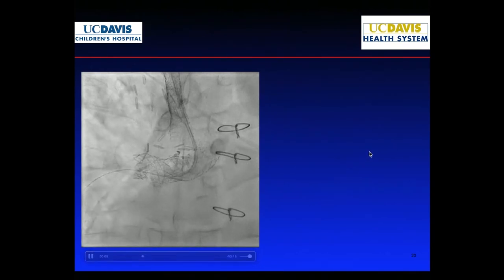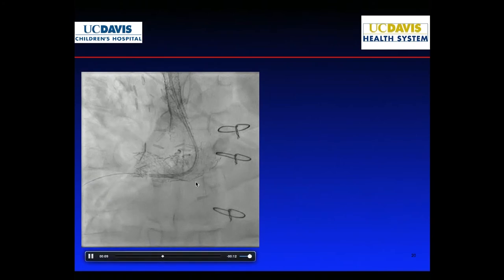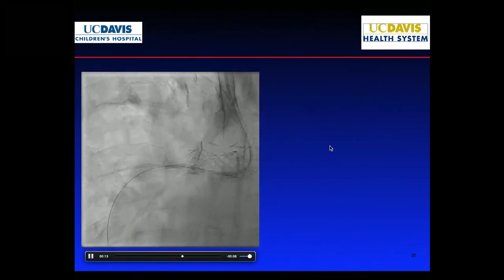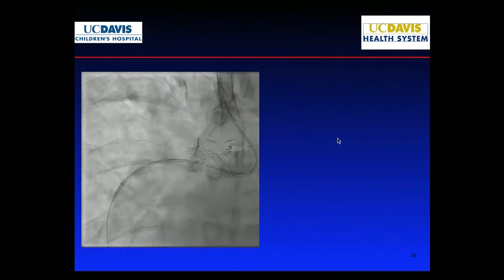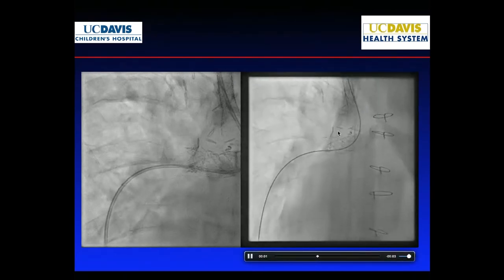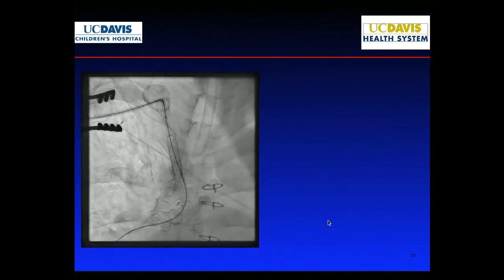And with that, we're able to, without having all the second curves, third curves, the force that you're pushing is translated towards advancing the catheter. So now we're making our way through the BT shunt, through the side of the stent in the right lower lobe, and now to the lower lobe. And now you have a nice course with a stiffer system in place that can allow you to proceed with getting a sheath in.